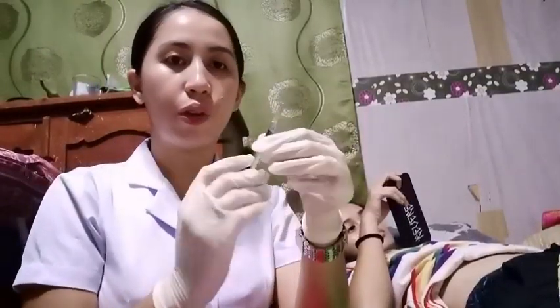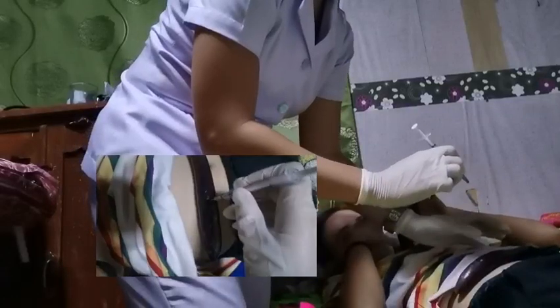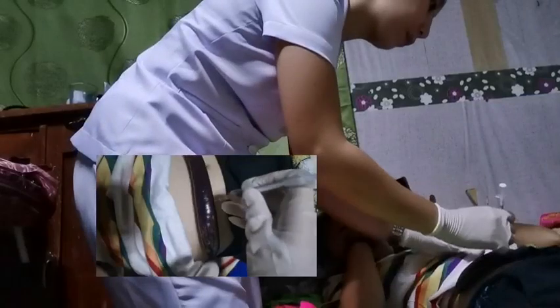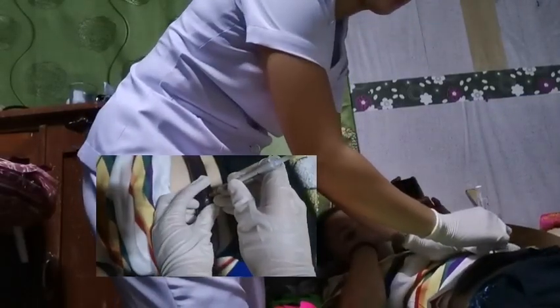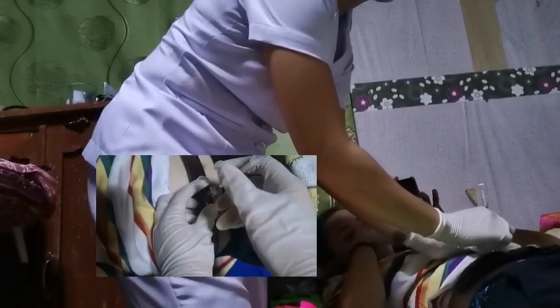Pull the needle cap off and hold the syringe between the thumb and the forefinger of your dominant hand, as if you're holding a dart. Now insert the needle quickly and firmly at a 45 to 90-degree angle. And then pain is minimized by inserting the needle without hesitation.